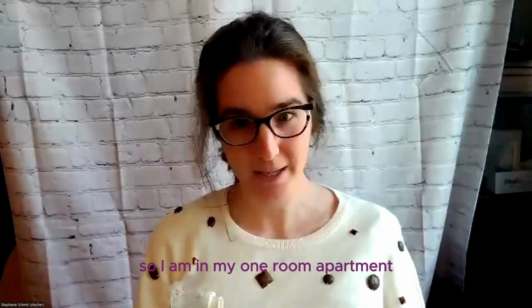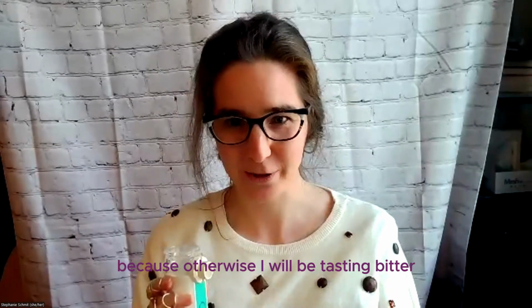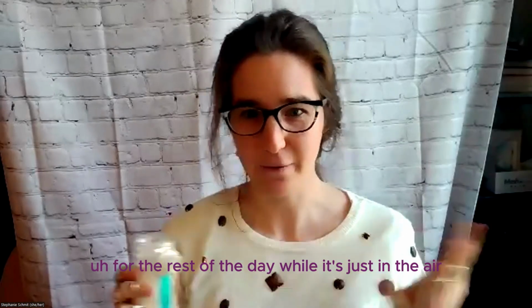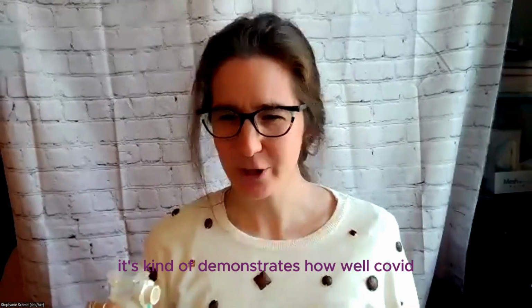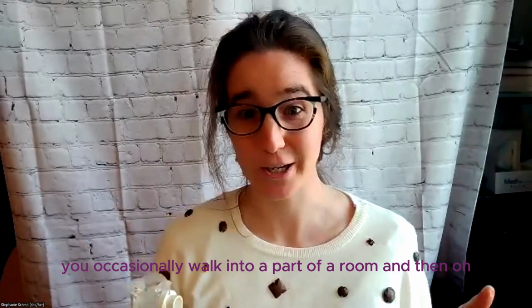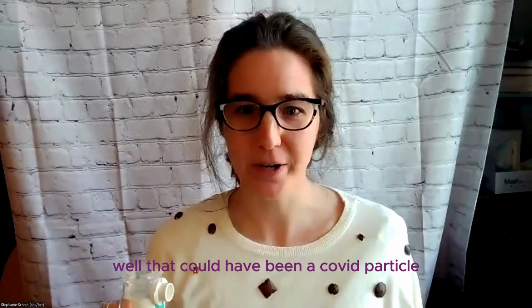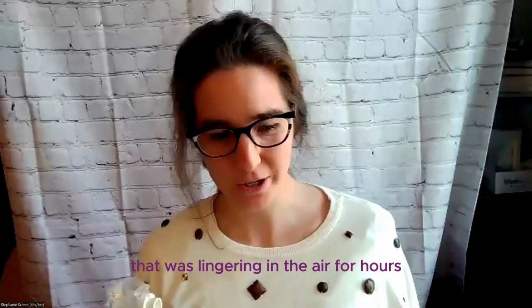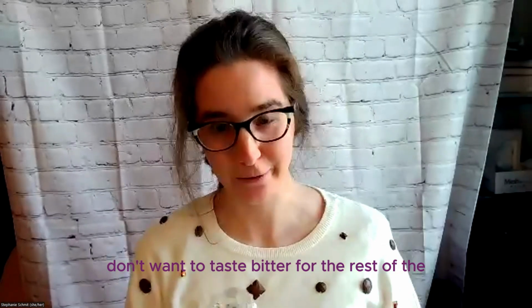So I am in my 1-room apartment, so I am not going to use the bitter because otherwise I will be tasting bitter for the rest of the day while it's just in the air. But it kind of demonstrates how well COVID and aerosol particles can stay in the air. If for hours later you occasionally walk into a part of a room and then, bitter. And it's like, well, that could have been a COVID particle that was lingering in the air for hours. So I'm using the saccharine because I don't want to taste bitter for the rest of the day.